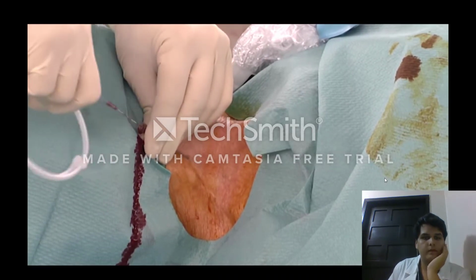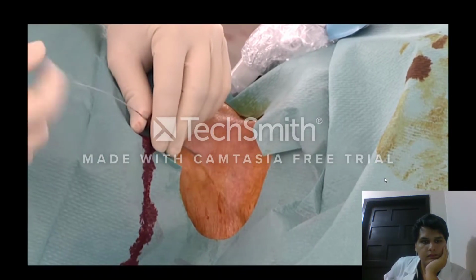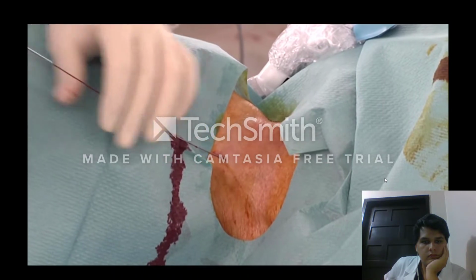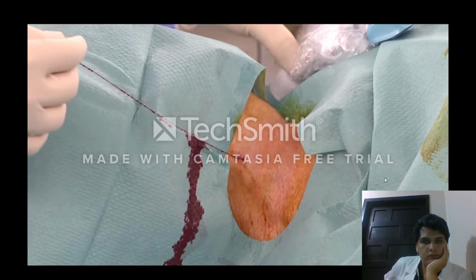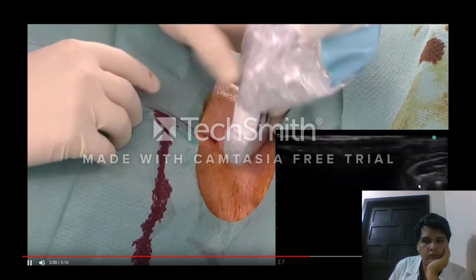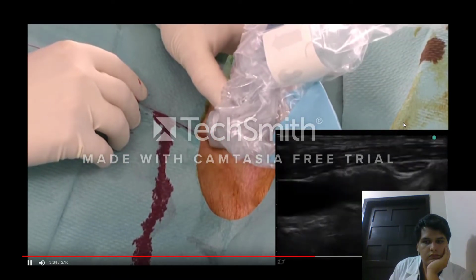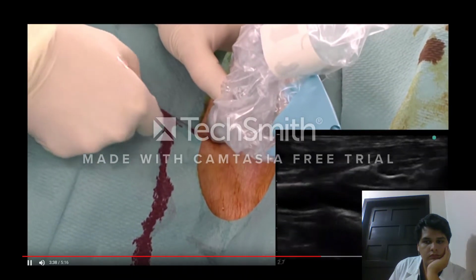If resistance is observed during the guide wire advance, as in this case, remove the needle and locate the wire using ultrasound. After verifying that the wire is in an intravascular position in the jugular vein, a new insertion can then be attempted.